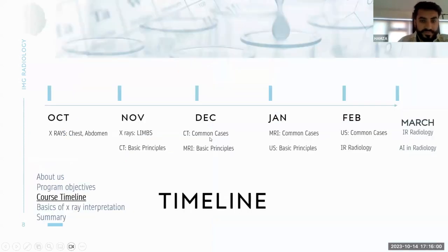All right, so we're going to be talking a little bit about what to expect. We're going to start off step by step. And I think the most common scan you'll be asked to interpret as a junior doctor is X-rays.